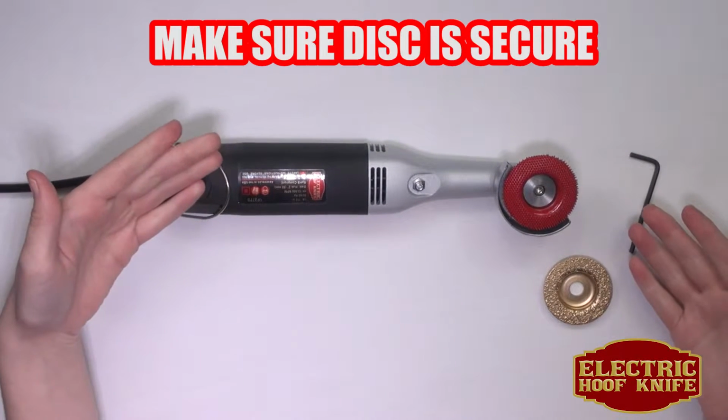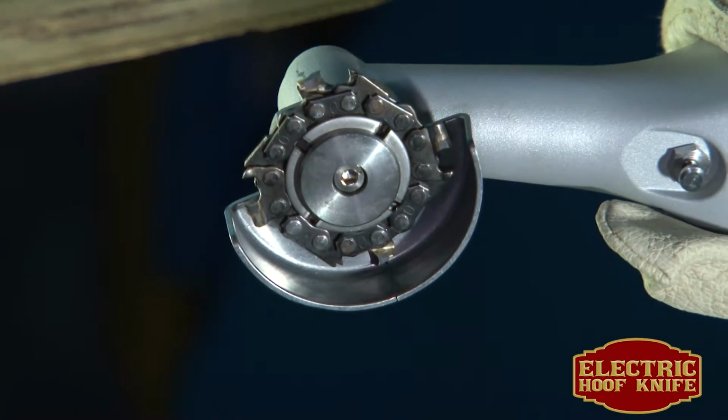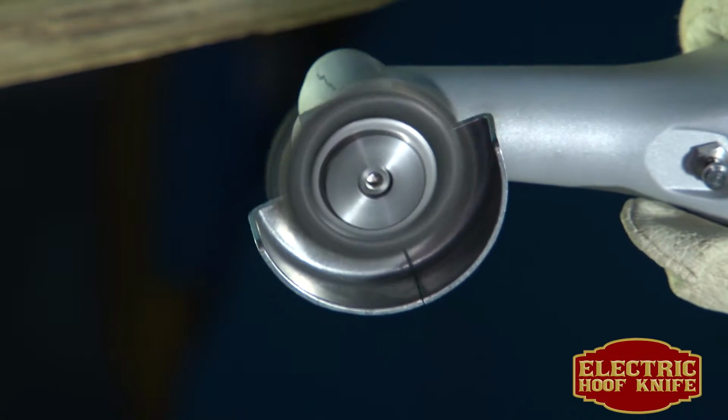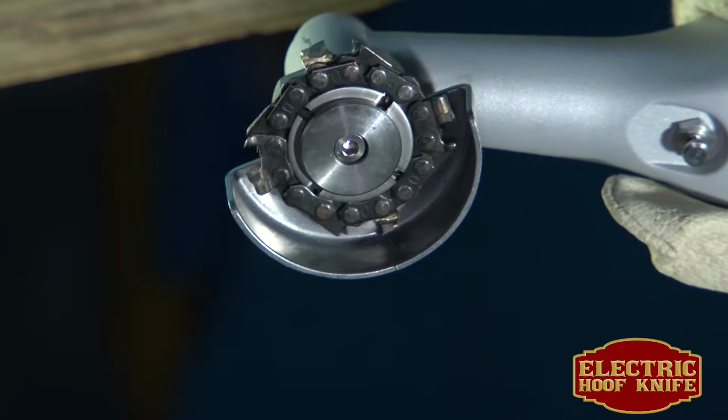Make sure the disc is secure and cannot fall out before turning on the grinder. While being sure to hold the grinder away from any animals or people, turn it on to test that the disc is seated properly and will not fly off during trimming.